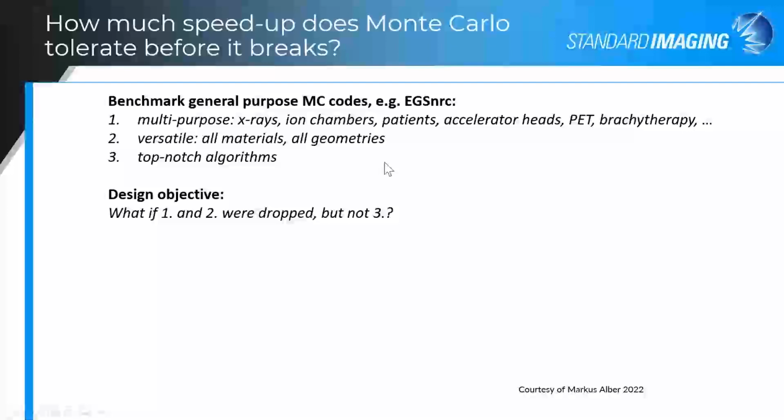No. And so you can use some different methods in order to optimize for the patient-specific anatomy and the material composition of the human body.